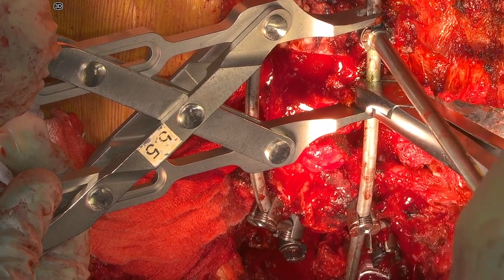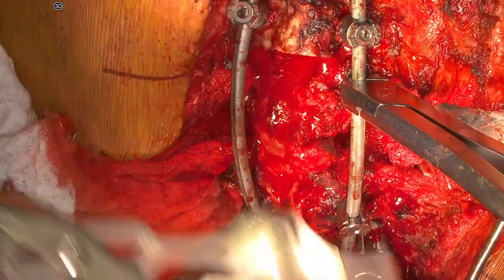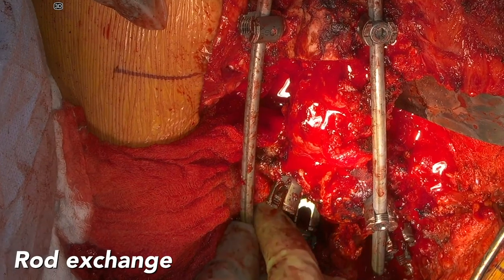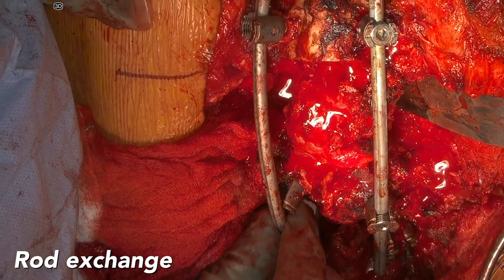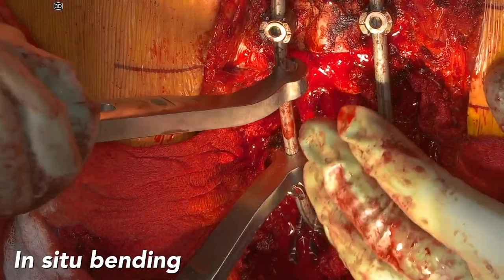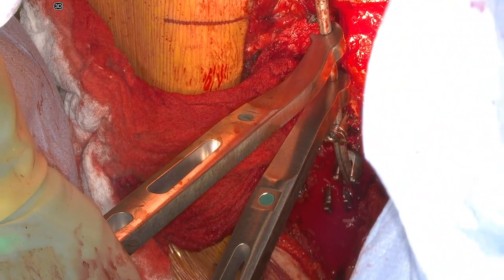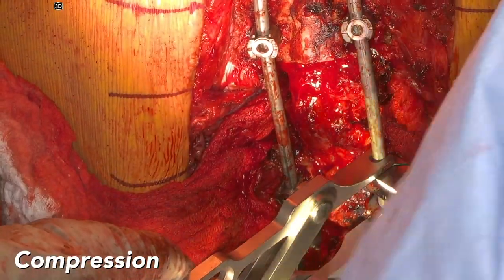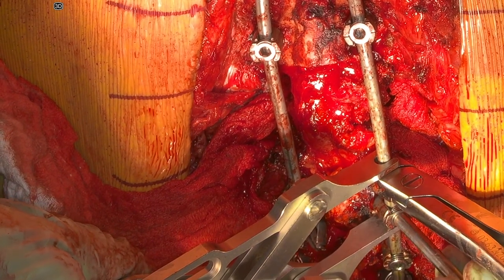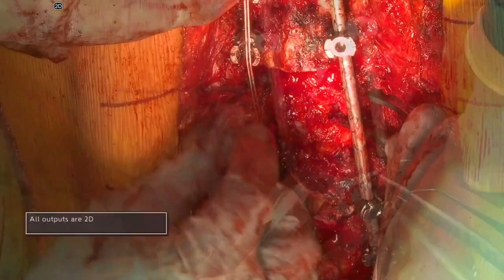Now compression is applied to the rods sequentially to shorten the deformity and relax the spinal cord. Sequential compression is applied and then the rods are exchanged a couple of times by taking out the rod, under-bending it, and then placing it on one side and then replacing it on the other side, thus decreasing the kyphosis. In situ bending is then performed. This maneuver eliminates the kyphosis but also angulates the bodies from a sharp angle to more parallel. Additional compression is applied through these temporary rods to create more correction, using cantilever compression and in situ bending.